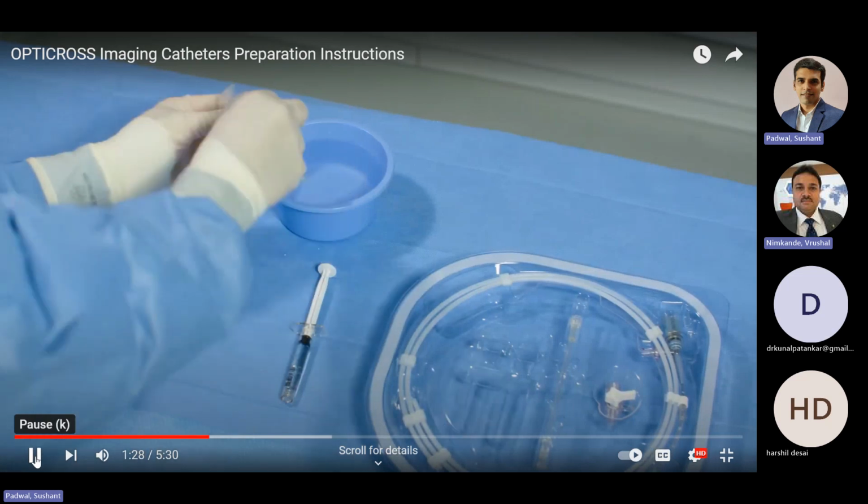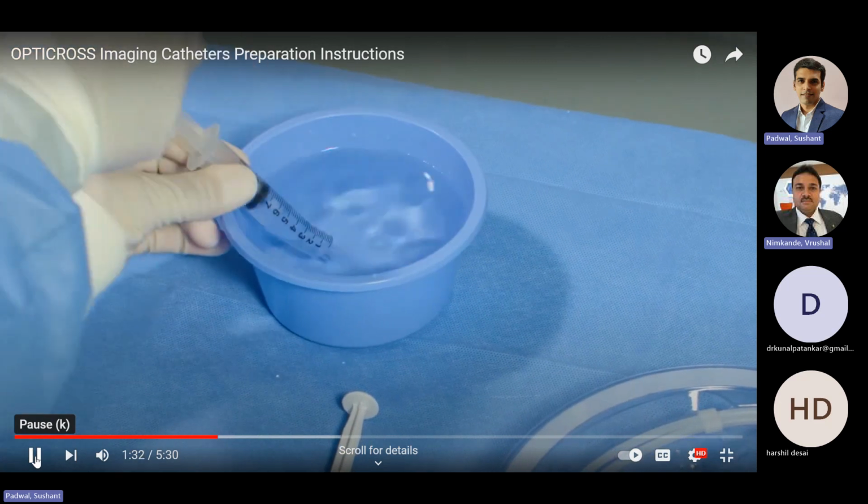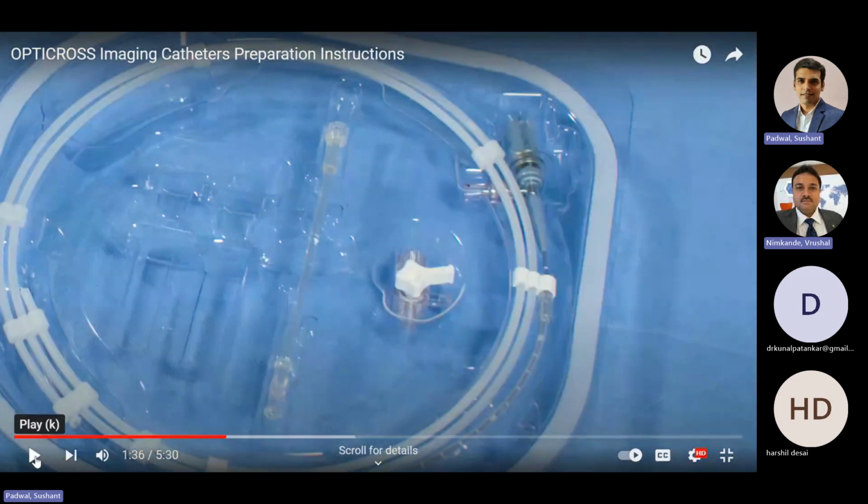And that is a fact. Even in your routine practice, if you fill up the syringe for the first time, you will see a lot of micro bubbles stuck on the inner wall of the syringe. If you rinse the syringe 2-3 times, then the third time you fill it up, there will be no micro bubbles.